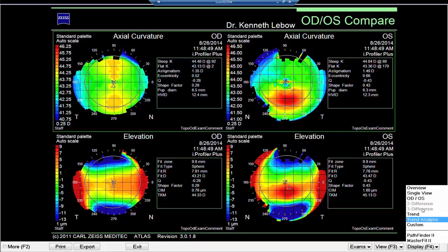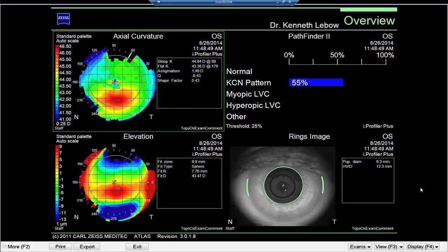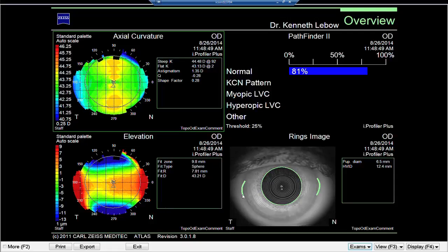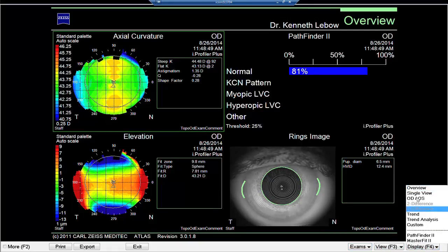If we went to the overview map, this is the right eye. When we look at the with-the-rule astigmatism, Pathfinder tells us very nicely that the likelihood of this eye being normal is approximately 81%. Looking at the with-the-rule astigmatism, there are no hot spots in the elevation map, and the rings are very normal — we have a very normal situation in the right eye.